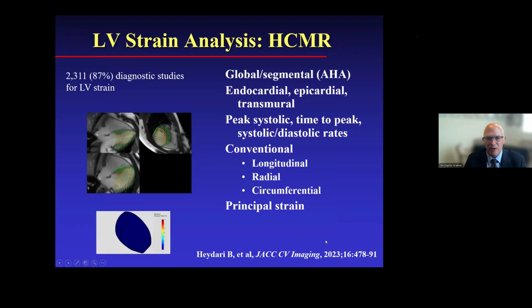As part of the baseline analysis, we did strain analysis. This was published back in 2023 in JACC Imaging. It was led by Raymond Kwong, who led one of our CMR core labs at the Brigham, along with James White at Calgary. They performed feature tracking strain on the cine images, measuring strain in every direction.